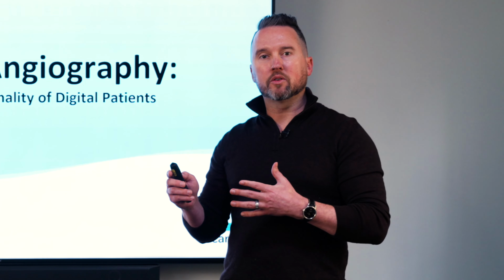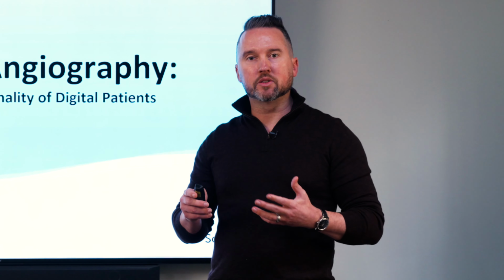Today I wanted to go over one of our new innovations, which is quantitative angiography, and from our perspective, the reason why our existing digital patient had to continue to evolve to make that a possibility.